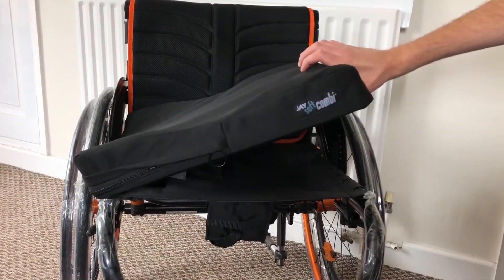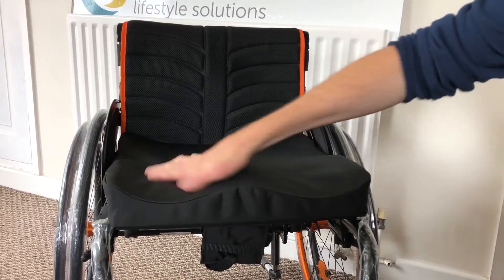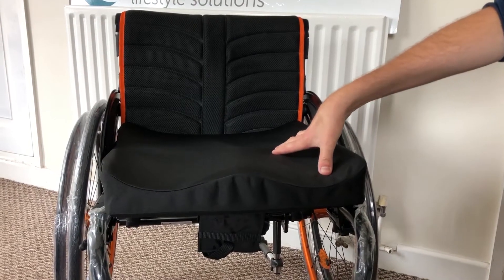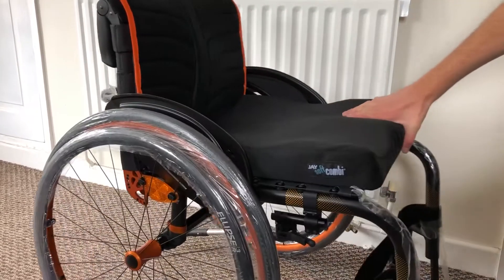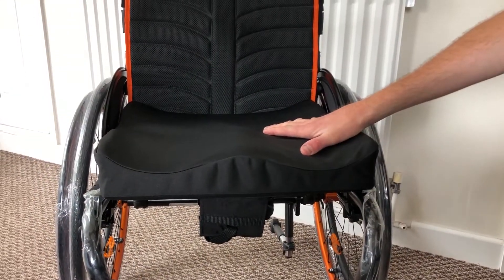The J Soft Combi Cushion is a great cushion. It's got a contour for your legs so it offers good stability and support, and although it's relatively firm it still offers comfort and most importantly pressure relief. The J Soft Combi Cushion is a great option in terms of a cushion for your wheelchair.